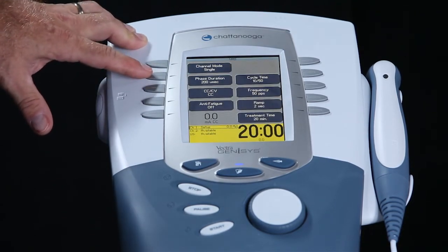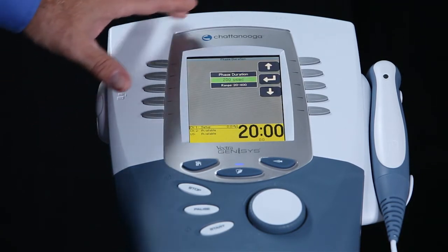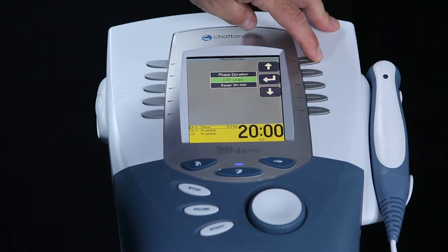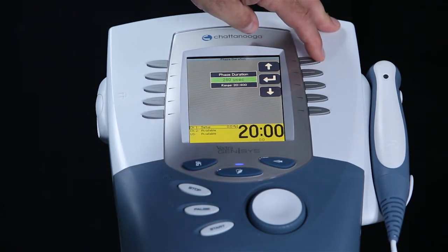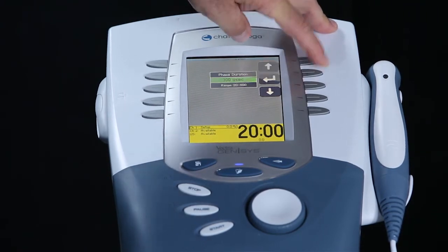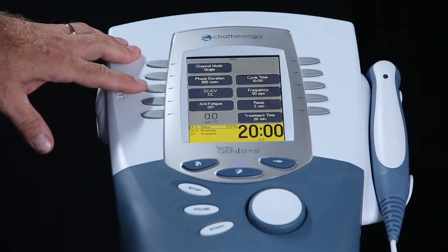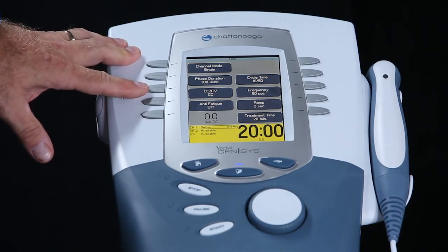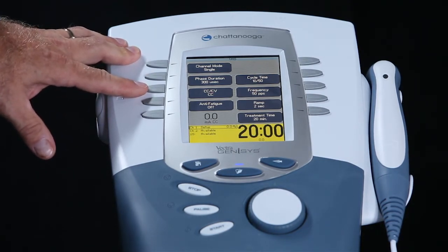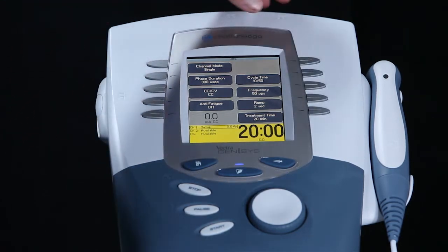Phase duration. Phase duration on the unit is set at 200 microseconds. Since the quadriceps is a large muscle group, we really want to increase the phase duration. Longer phase durations will create stronger muscle contractions and recruit more motor units. So we're going to 300 microseconds. If necessary, we can increase to 400. Constant current, constant voltage. In this case, we want to set the modality to constant current. The purpose is this will maintain the current flow, again, to get an adequate muscle contraction.